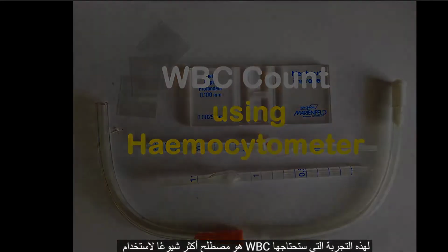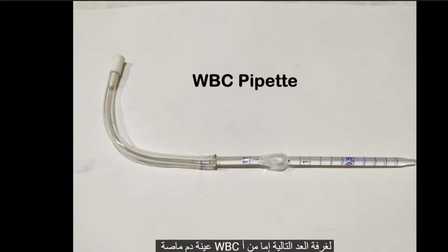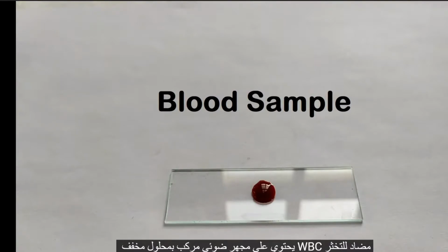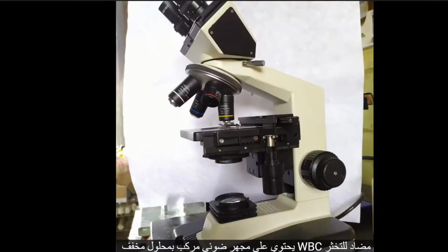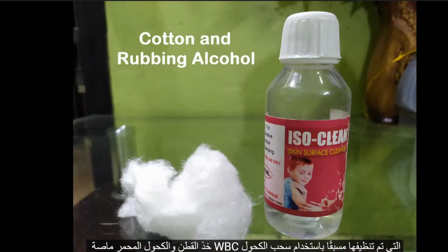For this experiment, you will need the following: counting chamber, WBC pipette, blood sample, either from a pricked finger or from a sample drawn from the vein and stored in a tube containing an anticoagulant, WBC diluting solution, compound light microscope, cotton and rubbing alcohol.